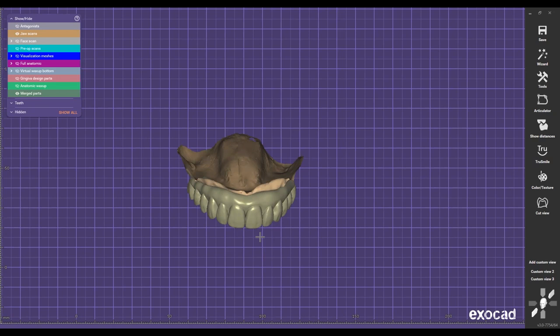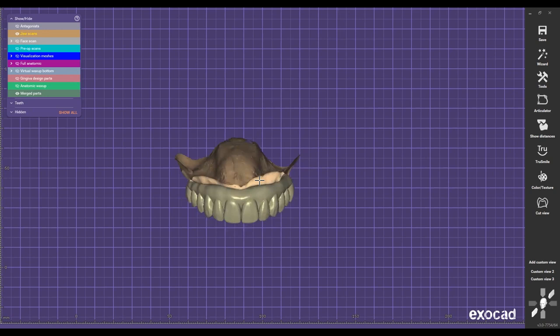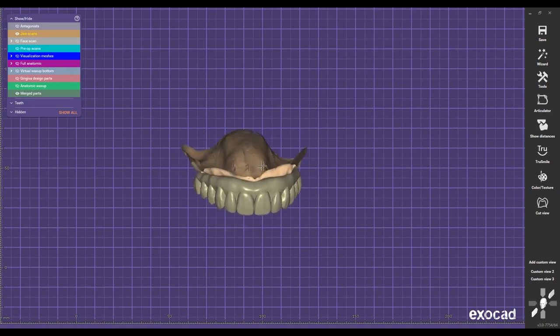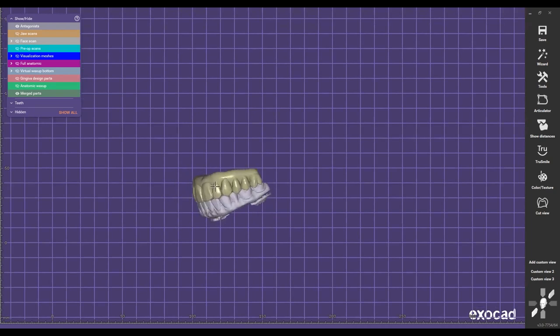I was able to understand the whole picture, working side by side with him in every case, asking him questions in every case as much as possible, so I could absorb all that information and learn from it. That's how we are now able to do these cases very confidently, because we understand those concepts, and I just apply them digitally, and we're able to deliver these cases beautifully. You can get this done in Europe, Dubai, everywhere. Just start using a facial scanner, and you can see how this is going to change your perspective and how you can get these cases done.